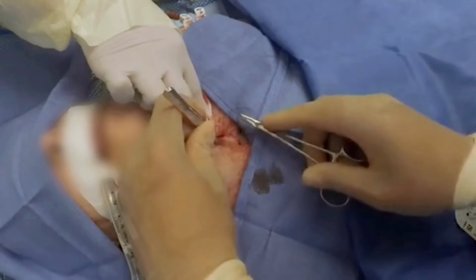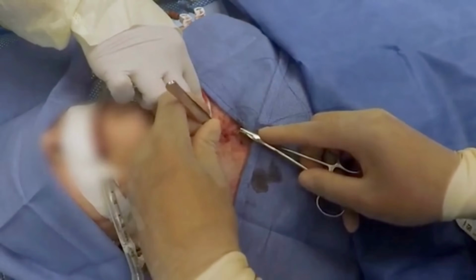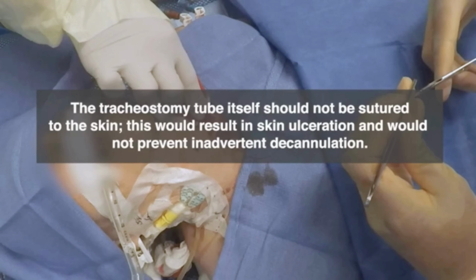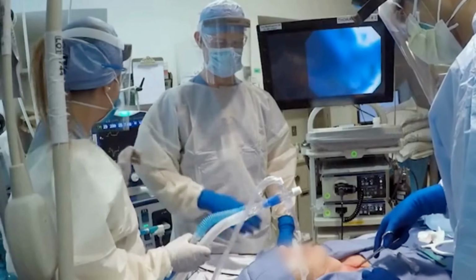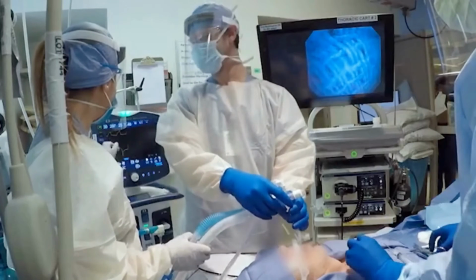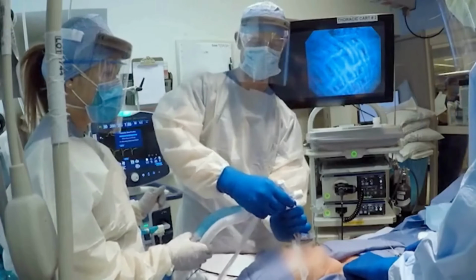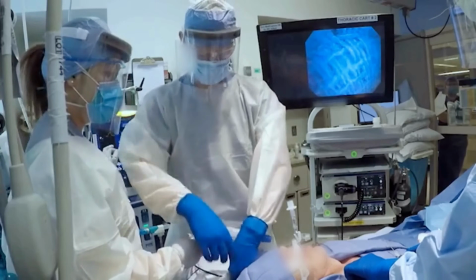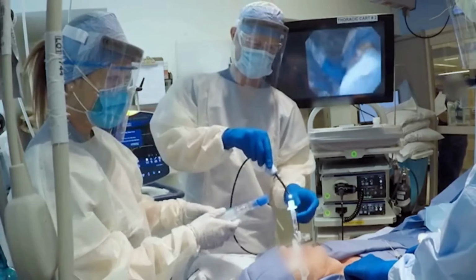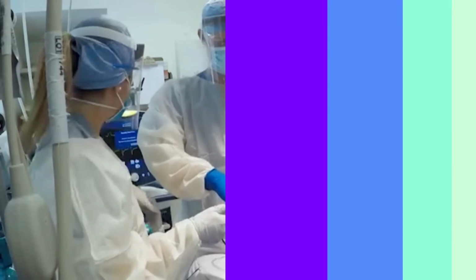This technique is not elegant. It is decisive. A surgical airway is not a failure of skill. It is the final step of airway management when all other options have been exhausted. Every airway algorithm ends here. The only question is whether the decision is made early enough. Once the airway is secured surgically, the priority shifts from access to oxygenation.